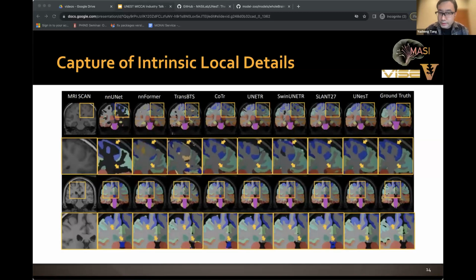Okay, so here's the visualization comparison across baseline methods and our approach, showing that our method better captures boundaries and correctly segments brain tissues. You can see that compared to the prior state-of-the-art method, for example the 27 3D UNets, our method, a single network here, can outperform that and achieve a detailed segmentation of the interconnected boundaries of these human brain tissues.